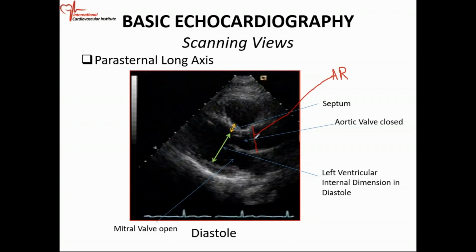Measured in diastole, and it's the aortic root. You need to say where you're measuring your aortic root. Is it at the sinotubular junction? Remember, when you get to the sinuses, the sinus sort of outpouches. So if you measure it from sinus to sinus, then it's going to be there. If you're measuring from the sinotubular junction, this is the tubular portion and this is the sinus. So you measure from the sinotubular junction, it's right there.